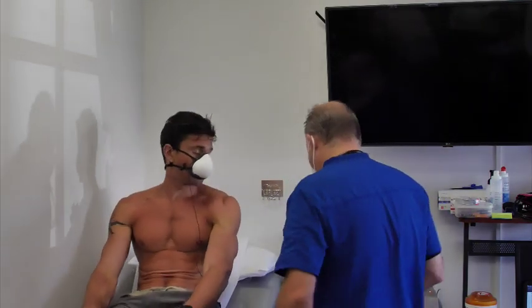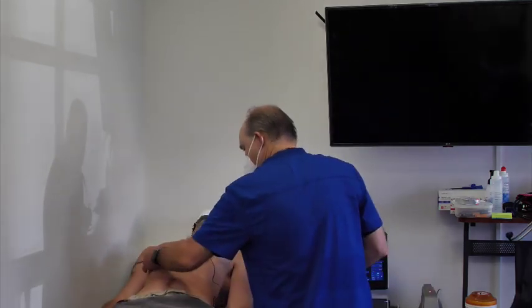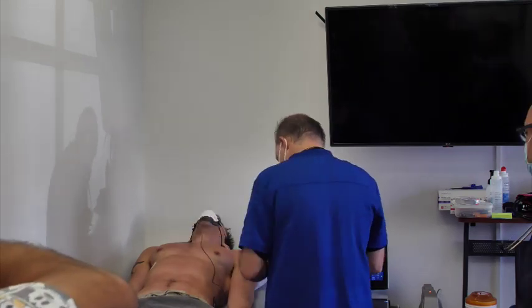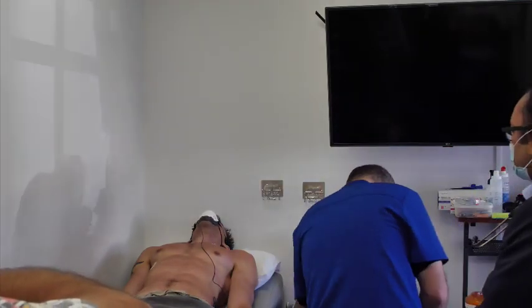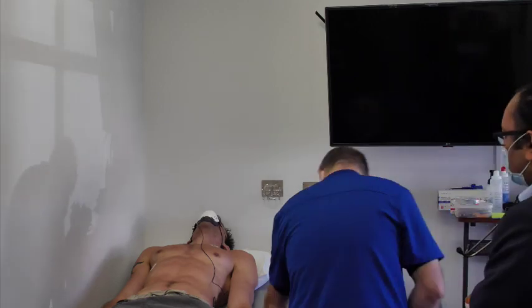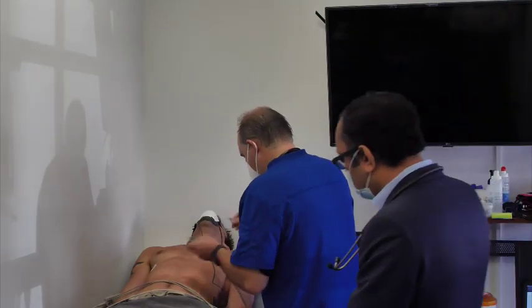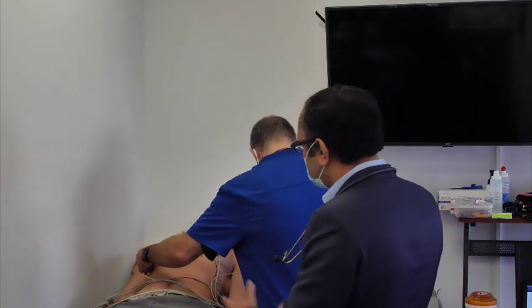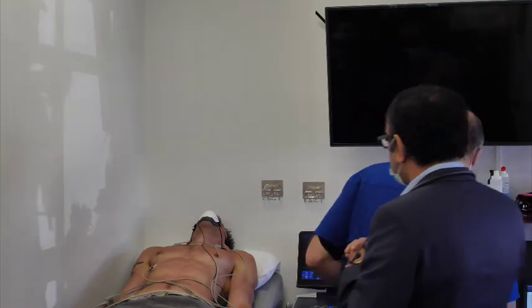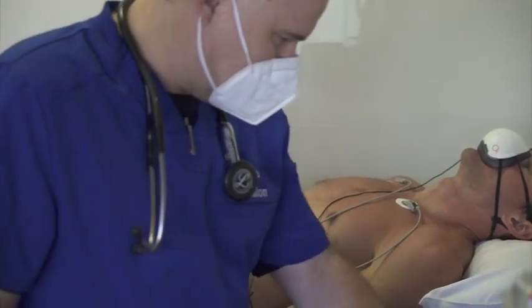Go ahead and lie on your back with your head on the pillow. One thing that many healthy, active people will find on an ultrasound like this is an enlarged heart ventricle — also known as athlete's heart, or cardiomegaly. We see this not infrequently with our athletes. We take some very specific measures and physiologic parameters to assess whether this is creating an impact on cardiac performance or it's part of that athletic heart pattern.